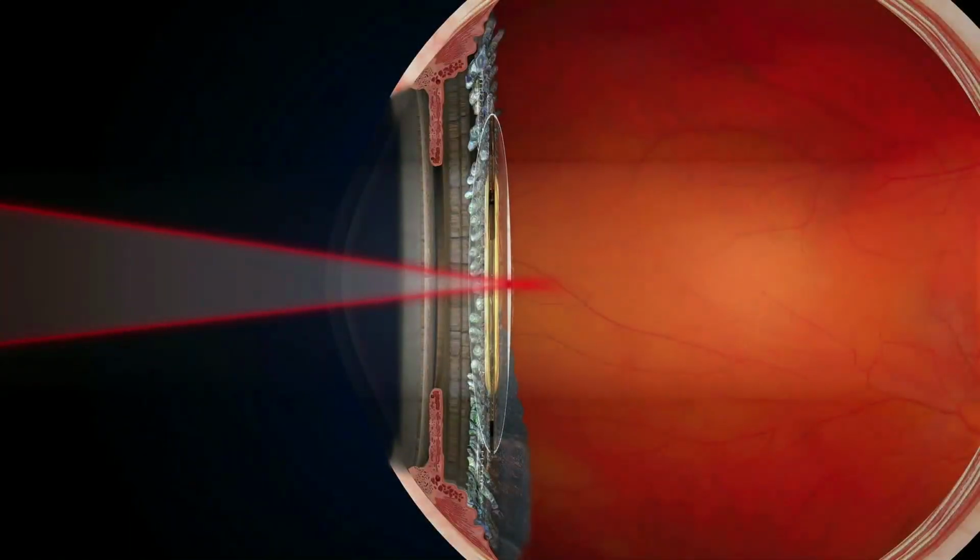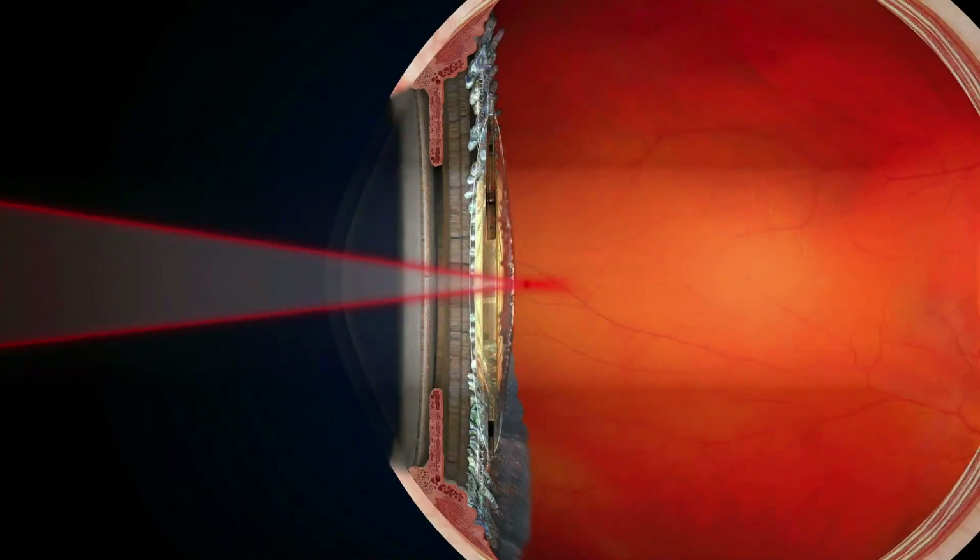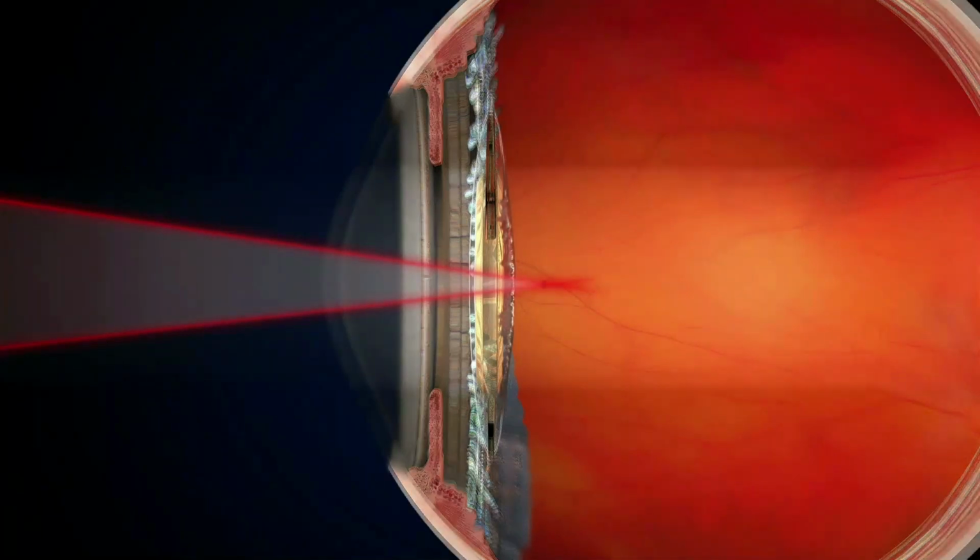I personally do not use this option, but focus the laser manually 1.5 to 2 millimeters behind the capsule by moving the slit lamp towards the patient. Using this technique, IOL damage is virtually impossible.